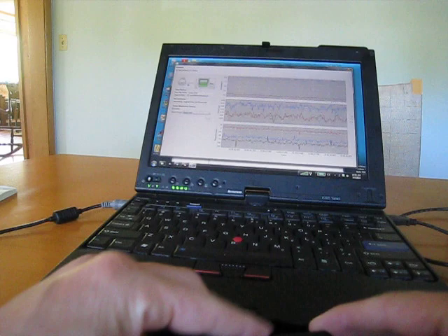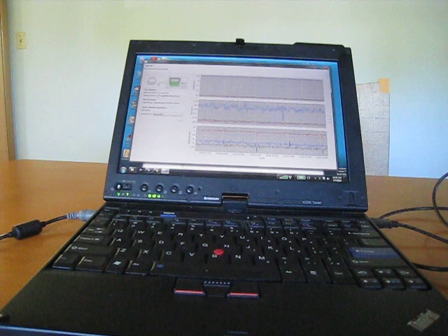If I set it on the table here for a minute, we can get a recording of what the data is like in stationary mode and get a sense of what the noise floor is of the sensors.